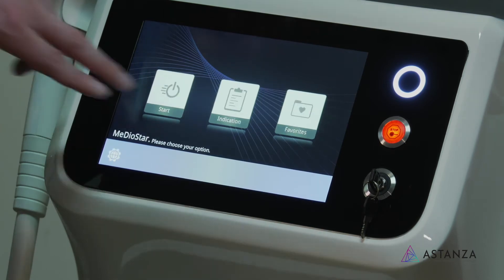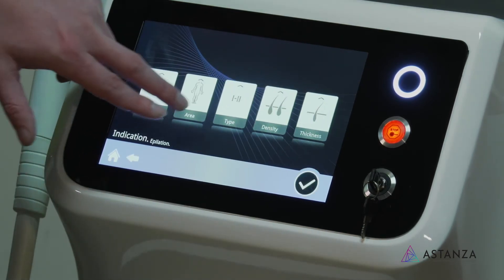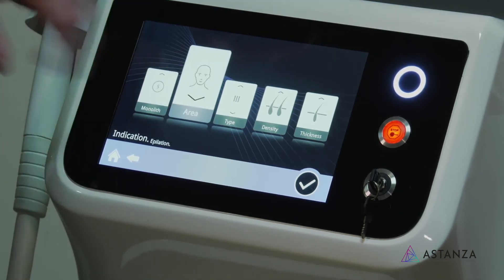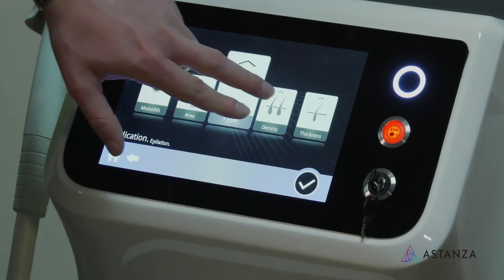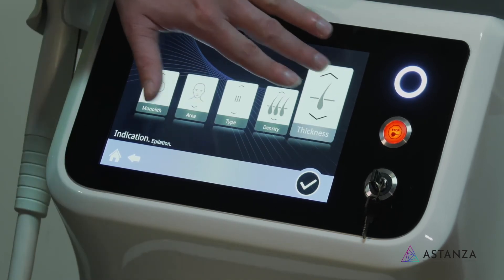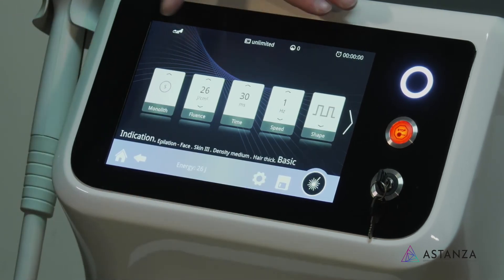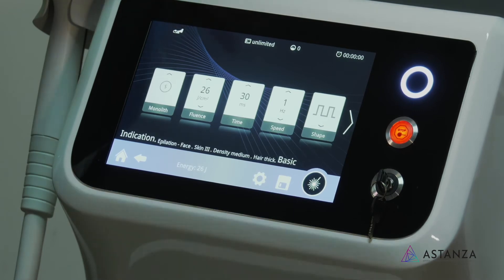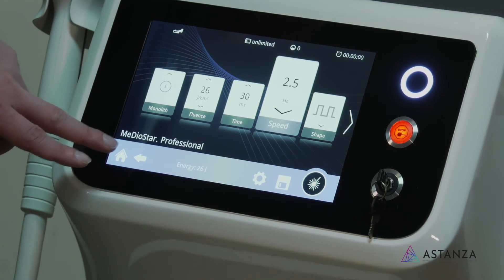If our next patient is a skin type three looking to do roughly the same thing, we'll go to skin type three, look at the area of the body on the face — but let's say it's a man's face and they're looking to line up a beard. The density is going to be a little higher, and the thickness a little bit higher as well. You can see it automatically changes the settings — pulse duration and joules change. And if you wanted to go a little bit faster, we can always do that depending on your comfort level.